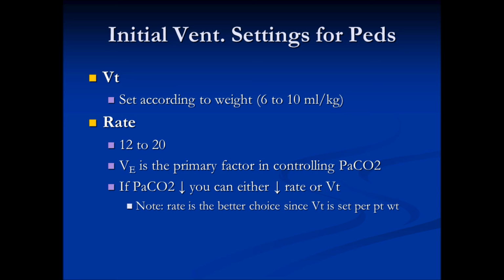Sometimes they make you determine what the tidal volume should be, but sometimes they'll give you a patient that's already on a vent with current settings, and you have to be mindful of the tidal volume they gave you. They may be trying to tell you that the tidal volume is too low or too high for that patient based on their ideal body weight. So if you didn't set the tidal volume and it's given to you in a question, always make sure that it is adequate for that patient based on their ideal body weight.